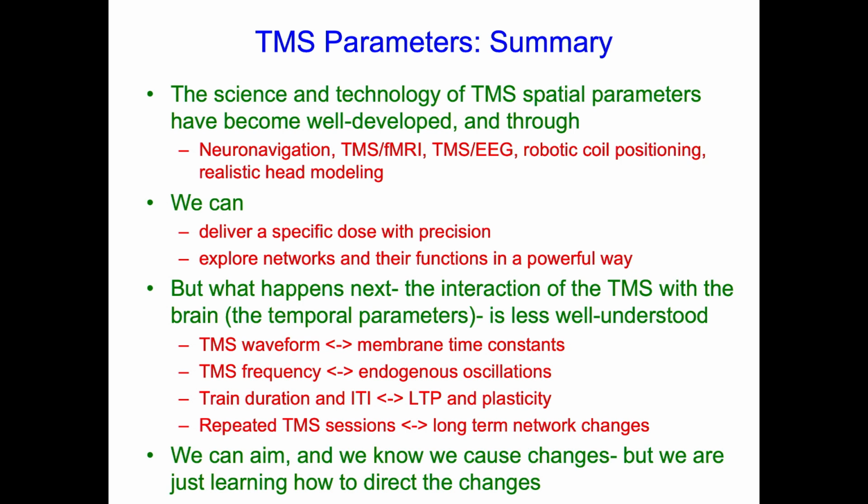And if you do durations long enough of TMS, you're changing long-term potentiation in the synapse. You're affecting plasticity mechanisms. And creating cumulative effects by repeated TMS sessions, hopefully creates long-term network changes that we can use therapeutically.